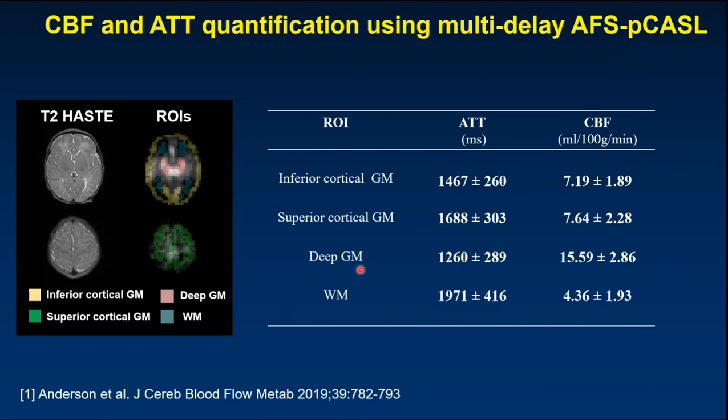So now that we have measured arterial transit time in neonates, we want to take a step back to the single delay ASL, because single delay ASL is more practical and more time efficient from a clinical point of view.